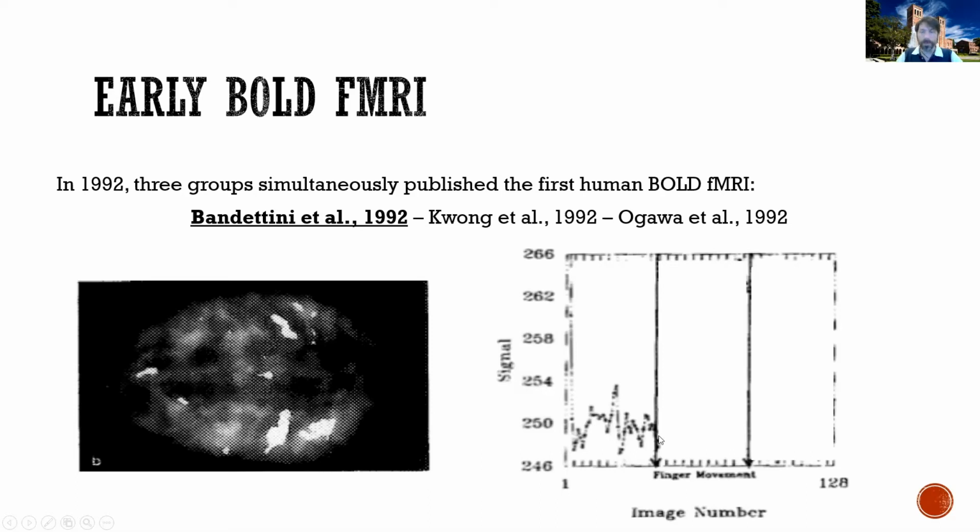And then suddenly we say, okay, now move your fingers, move your fingers. And here's what you see in the bold signal. The bold signal jumps up and then stays up. What is causing this? Well, this part of the brain right here, which is marked in white because it's the part of the brain that has a significant increase in its signal during task, there must be a lot of oxygenation going to that part of the brain since the signal became stronger.